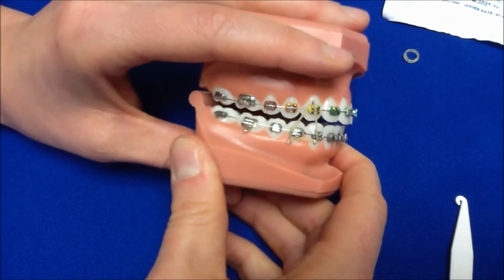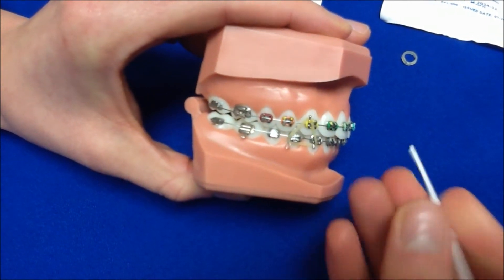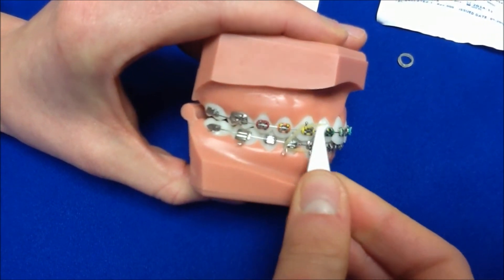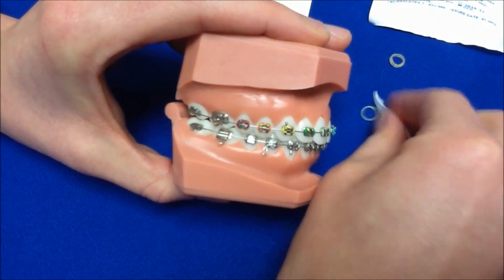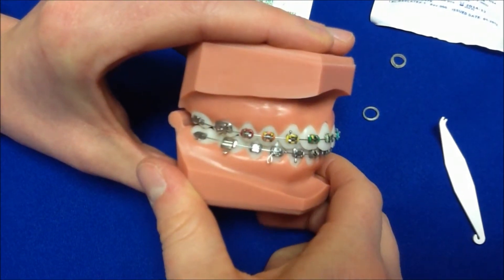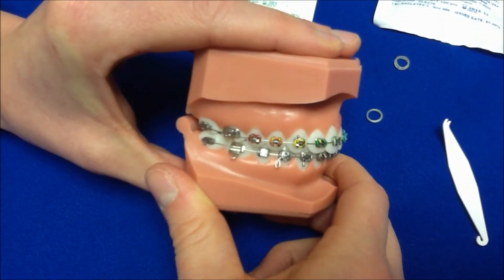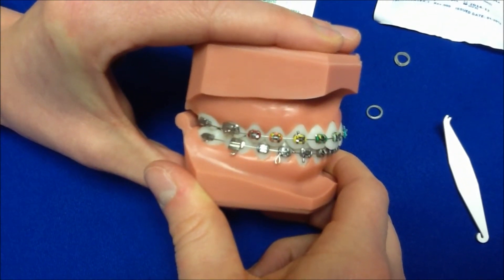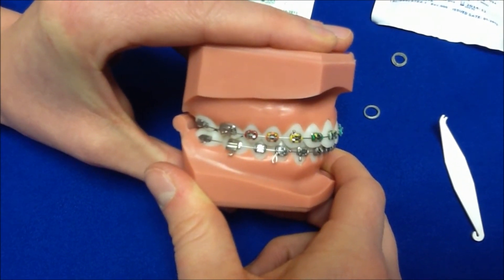Always remember that you should wear your elastics exactly as you are told. If we ask you to wear your rubber bands all the time, that means they're only taken out to brush your teeth or to change and put a fresh set in. You should change your rubber bands three to four times a day, always before you go to sleep at night put a fresh pair in, and after you eat.